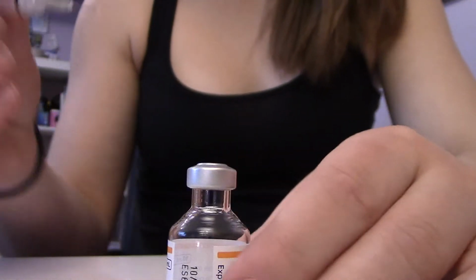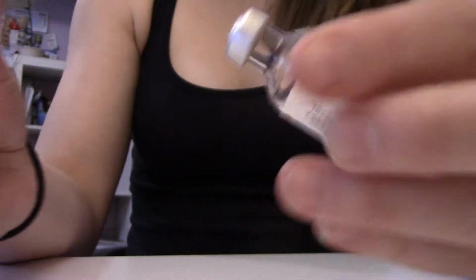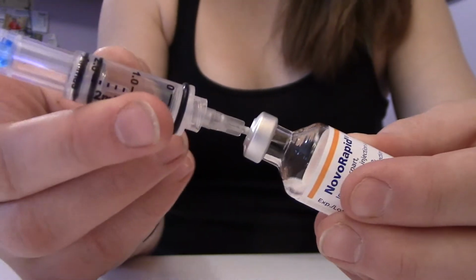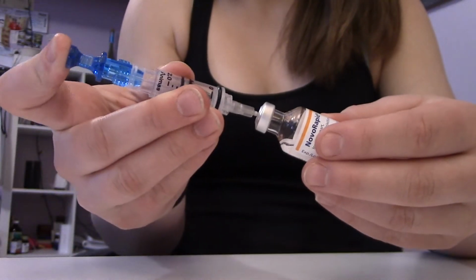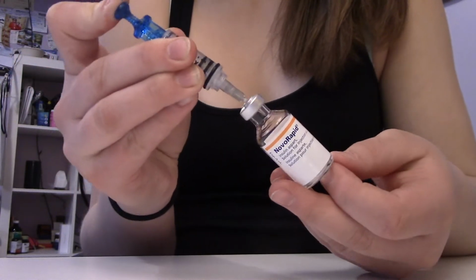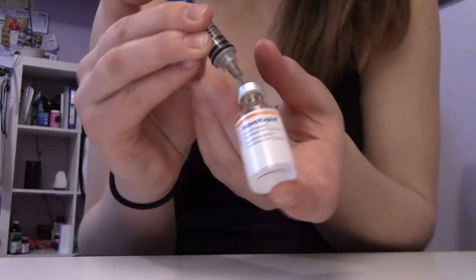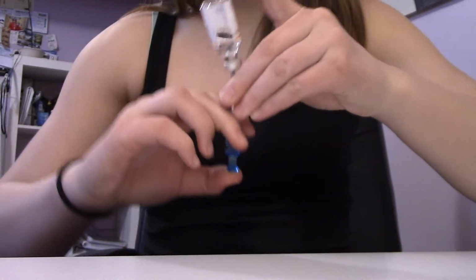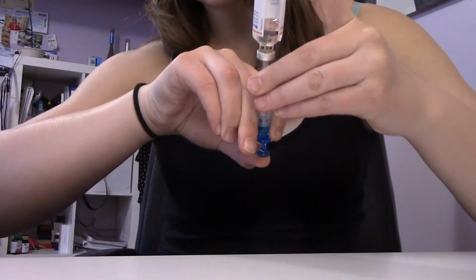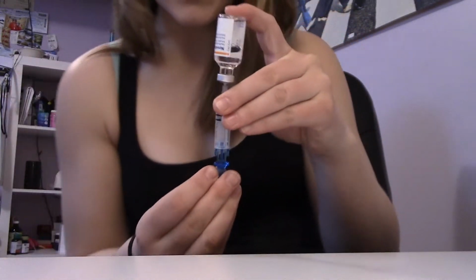Okay, so next I'm going to push that air that I just drew into my insulin cartridge. So you can do it on either way you want. Just go like this, and then I'm going to push the air in. Okay, for this next part, you want to make sure that you invert the insulin part completely upside down. That way you can avoid getting any air bubbles. So I'm going to flip it like this. I'm going to pull out that amount of insulin that's equal to the amount of air I just pushed into it. So all you have to do is just pull.